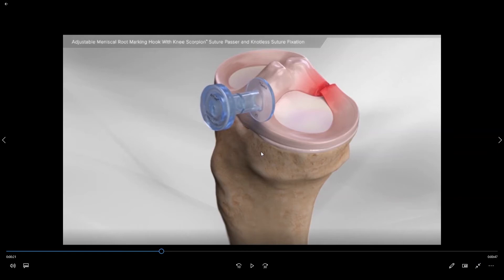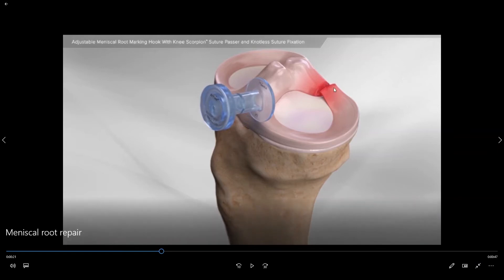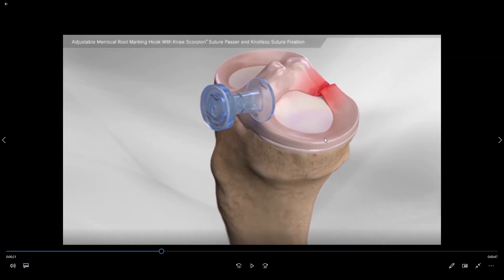Because of that, we recommend fixing posterior root tears in order to re-establish the attachment of the meniscus to the floor in this location. That way, once you go to place weight on it, it will no longer be pushed out away from the two bones and it will again provide the shock absorption necessary to the joint.